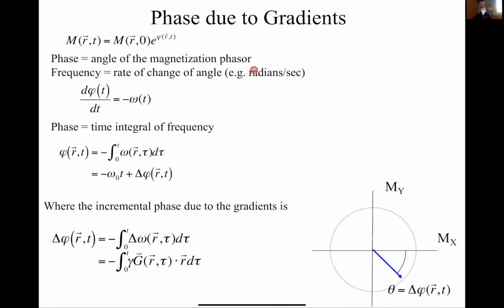So now we want to take that frequency difference and go into phase. Because remember, the examples we've done so far, we're looking at the phase pattern. The thing to remember about MR as you go through the MR experiment is that essentially every point in k-space is a different phasor pattern. So to get all the points in the Fourier domain, you've got to impose different phasor patterns. You impose this phasor pattern, calculate the Fourier transform, impose another phasor pattern, calculate the Fourier transform. You go on and on until you've collected enough points in Fourier space that you think, okay, now I have enough points that I can reconstruct my image.